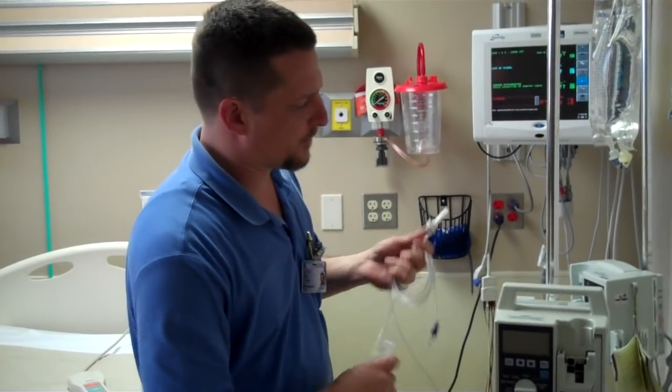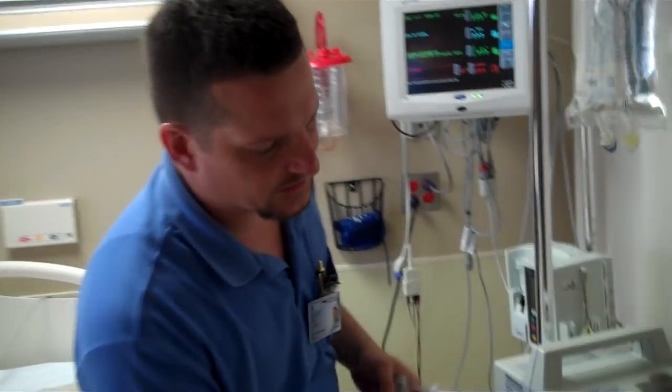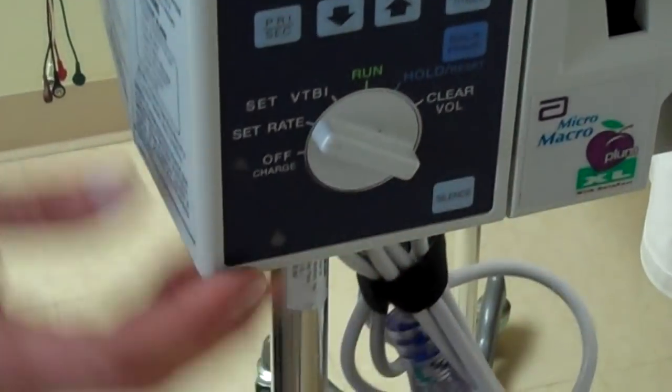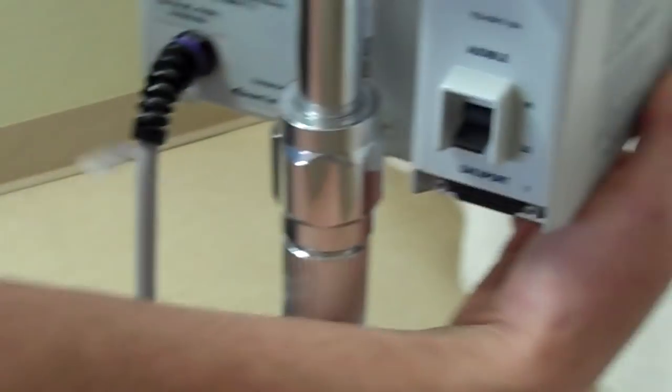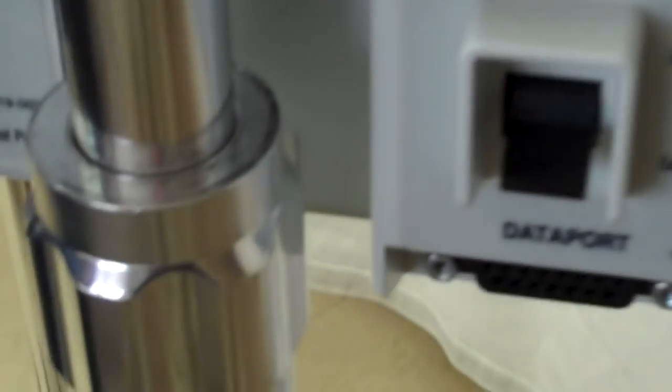When you first turn it on, we'll turn the unit to set right, then verify on the back of the unit that the audible alarm switch is in the low position. We listen for the alarm, and when we hear it, we switch to the high position. If we hear that alarm, then the unit is ready for use.